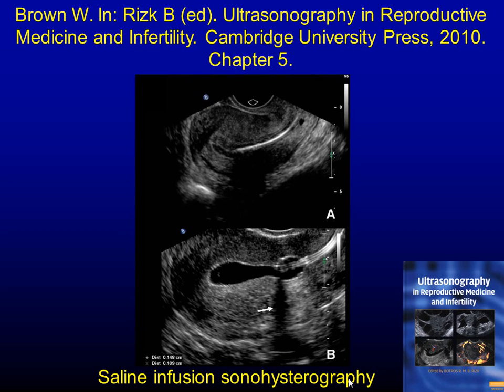This is just putting a catheter. You can use one of many catheters that are used. The catheter always has a balloon, which typically takes 1 cc of water or saline. And this is a perfect lining. You see the lining is a thin line. Similar to ultrasound, you see the lining shining as a white line as well there. If that lining collapses, you see a white and then black and then white line as well in the midline.